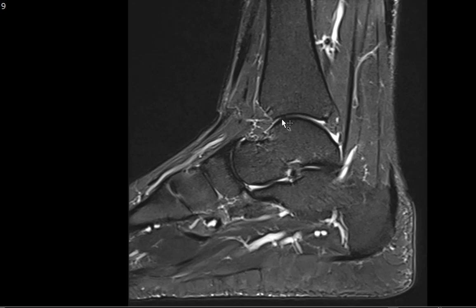Hello, my name is Omar Awan and I'm an associate professor of radiology at the University of Maryland School of Medicine. Today I'd like to talk about my approach and evaluation of MRI examination of the ankle.